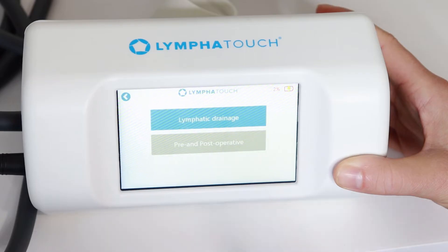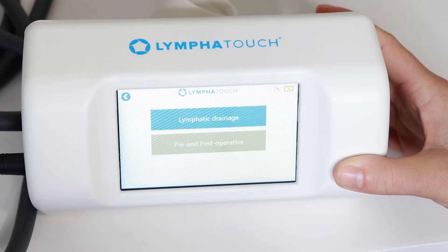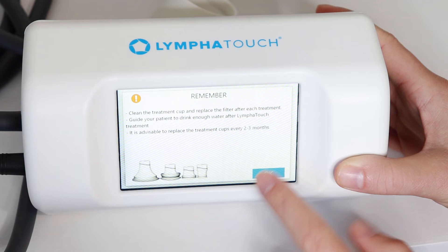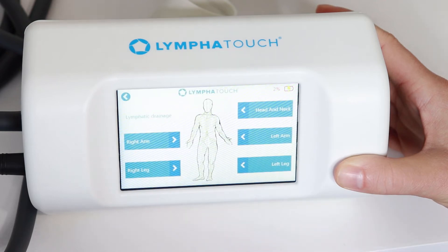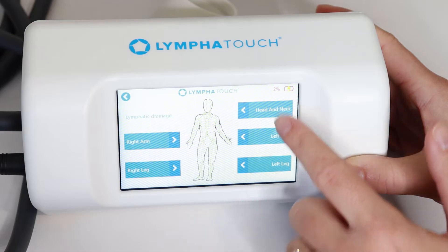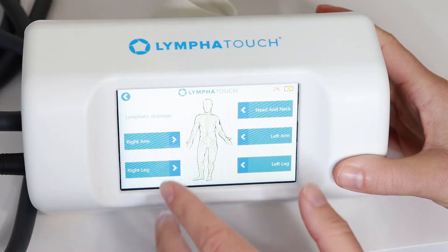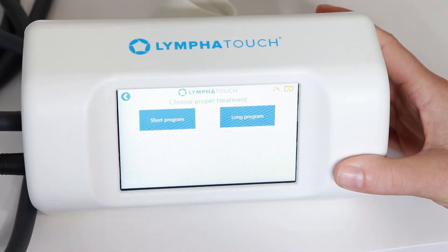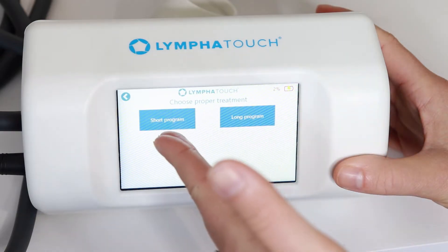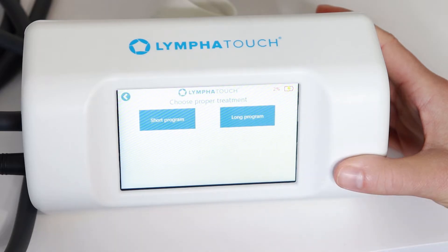When we talk about lymphatic drainage and lymphedema, we have pre-set programs. There are pre and post operative options for orthopedic or scar tissue issues, as well as a lymphatic drainage route. It's broken down into right arm, right leg, left leg, left arm, and head and neck area. Depending on what part of the body we want to treat, we pick a protocol — and then choose between a short program of about 20 minutes or a long program of about 30 to 40 minutes.